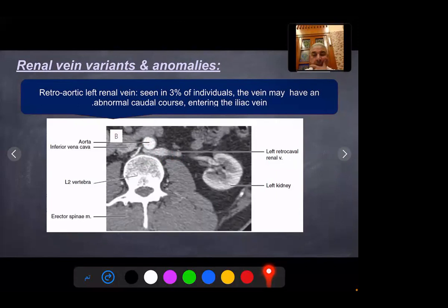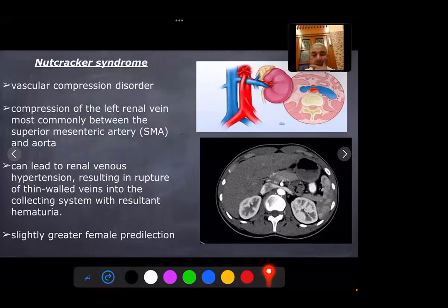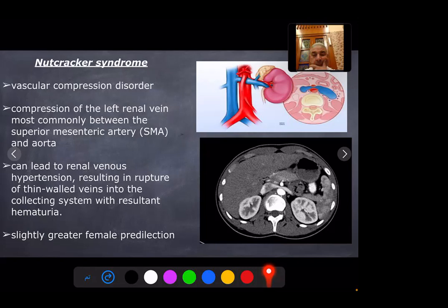Nutcracker syndrome is a vascular compression disorder when there is compression of the left renal vein between the superior mesenteric artery and the aorta. It can lead to renal venous hypertension, resulting in rupture of thin-walled veins into the collecting system with resulting hematuria. It has a slightly greater female predilection. Axial CT shows the left renal vein compressed between the superior mesenteric artery and the aorta.